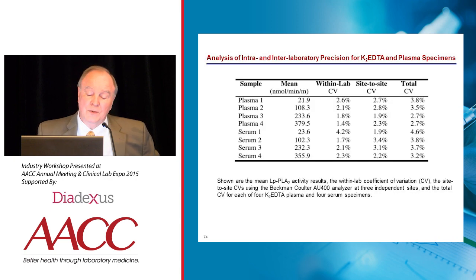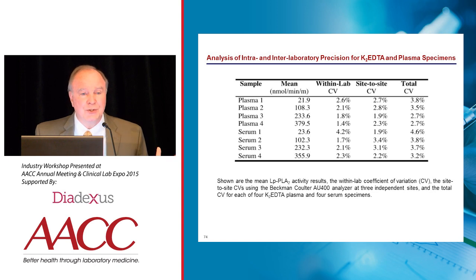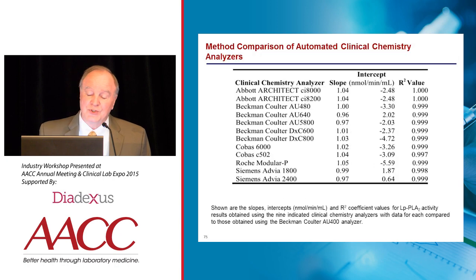The other thing we've been able to show is the precision of the assay between 3 different laboratories being in the range within lab precision, being about 2%. Now, the beauty of this is when a clinician like Dr. McCullough sees a change in the result between testing, he can be reasonably assured that the change is actually going on in the patient and not something going on in the laboratory. So we want a really precise test here in these various laboratories doing this test, and it looks like the test is set up is quite precise.